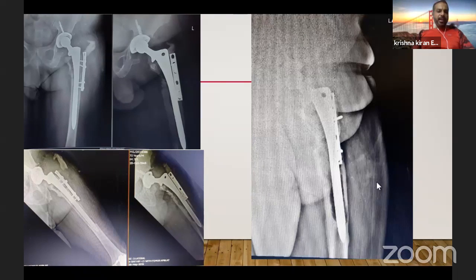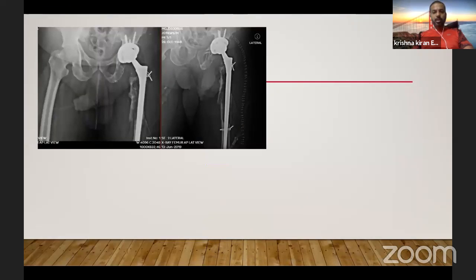So now this was an ideal case, if it were a young patient, for a proximal femoral allograft or the use of a modular stem. And as I told you, I have a little bit of reservation using modular devices, especially the mid-stem modularity. So we used a 305 monoblock Wagner to reconstruct it. You can see that there is around 6 to 7 centimeter distal fixation.